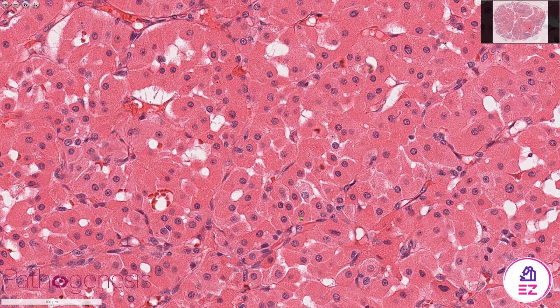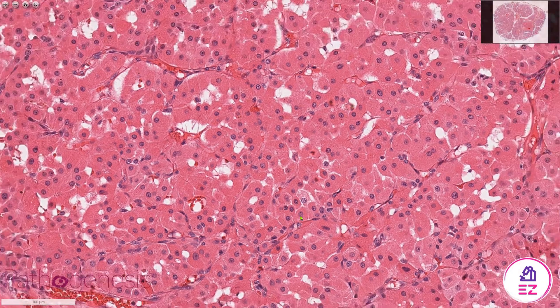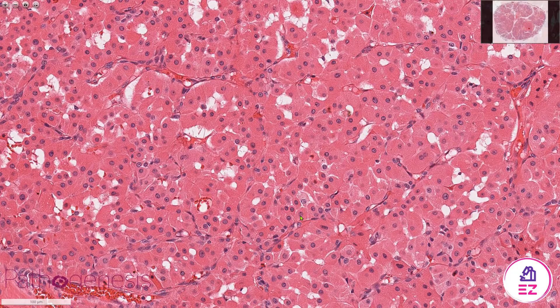Sometimes in oncocytomas you can see clear cell change, and when that clear cell change is prominent it might influence your differential diagnosis and make you consider other lesions — both of salivary origin or elsewhere — that have clear cells. But this particular example is very classic for a typical benign oncocytoma.